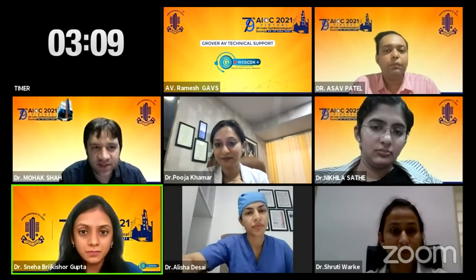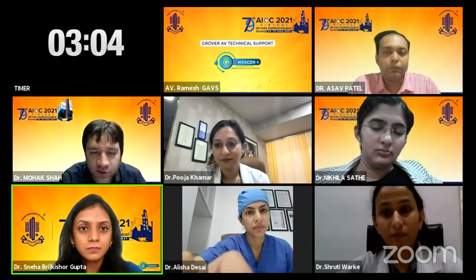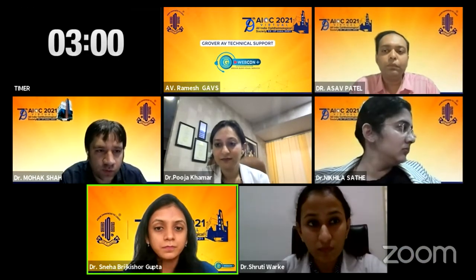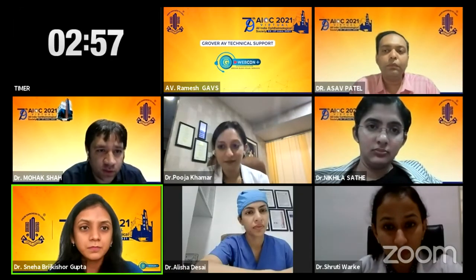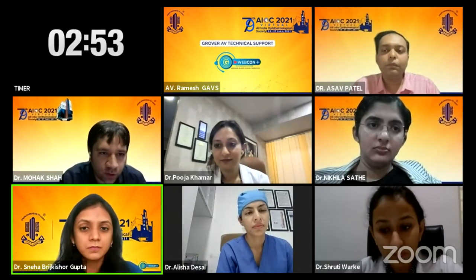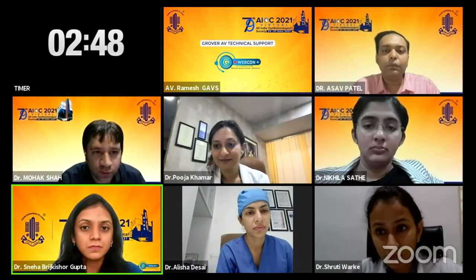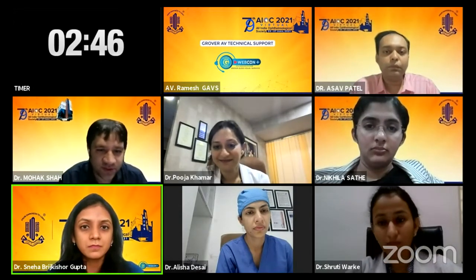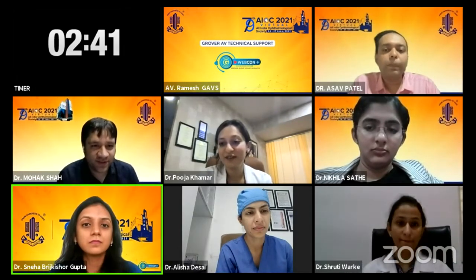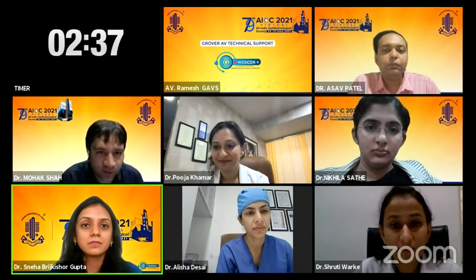Yes, I think Zeiss does this pupil tracking. So I am not very sure that this much decentration would be possible with the Zeiss MEL 90. But what we can do is turn off the eye tracker, and then definitely we can ask the patient not to move the eyes and the head. So we should have some control. I think it is possible. I have a couple of patients lined up, and you can also do it and let us know what happens. Yesterday only I saw this feature of the MEL 90, so I wanted to ask you. So far I have not treated anyone.